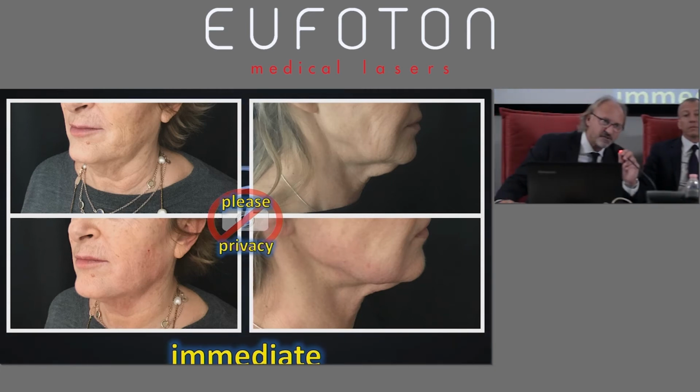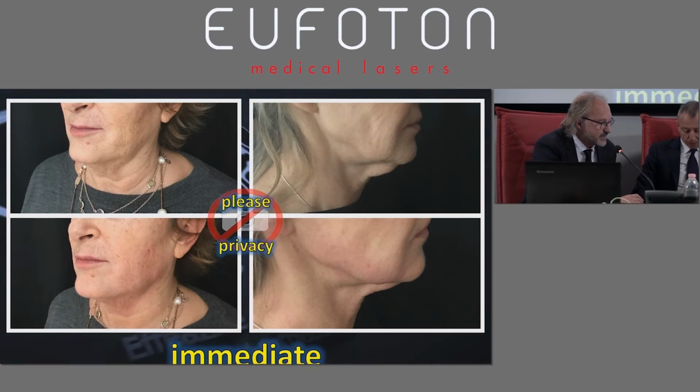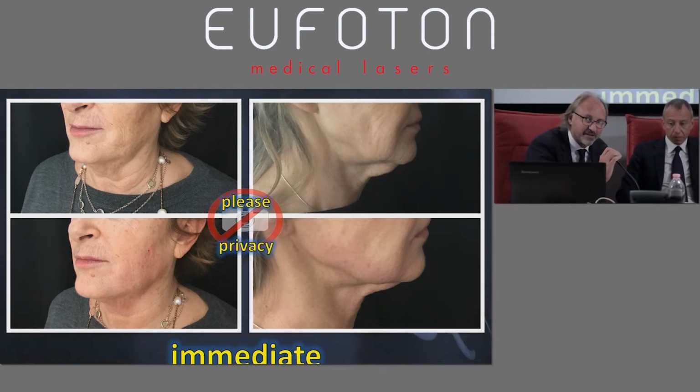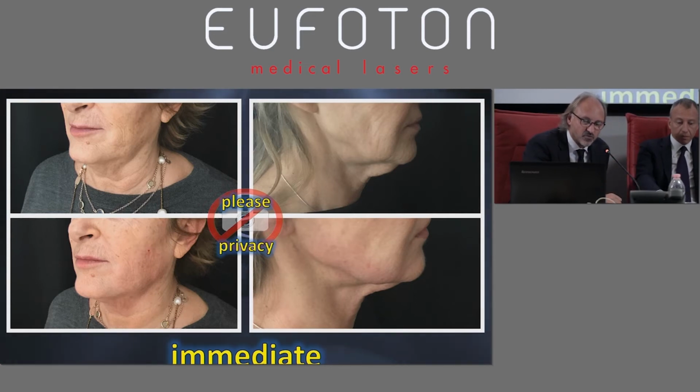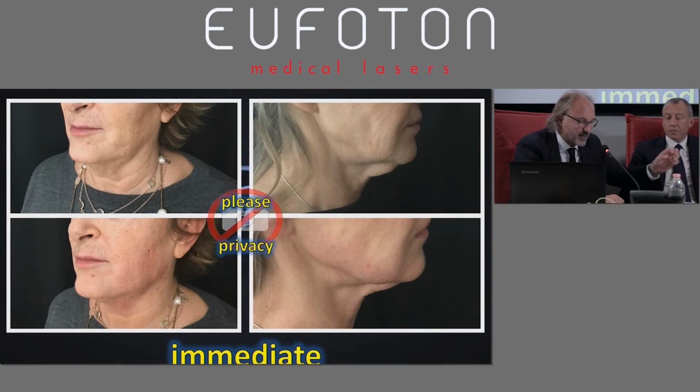So, you mean face or body? Body, yes. So, I mean, this has been fully described, this combined approach to skin tightening and surgery. The first step is skin tightening with some anesthesia, dry anesthesia.